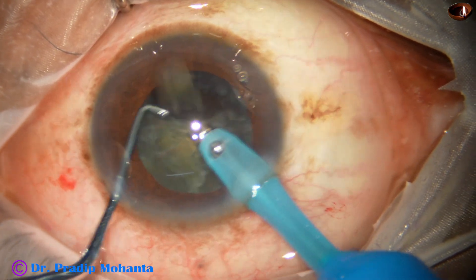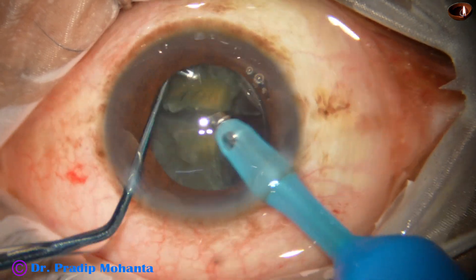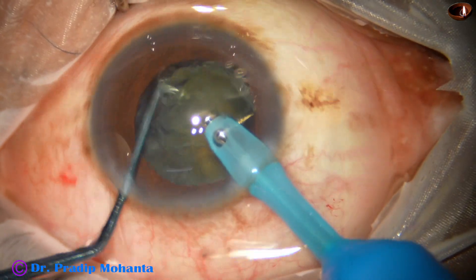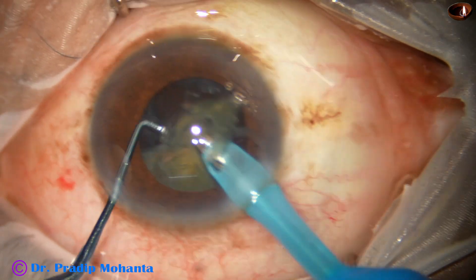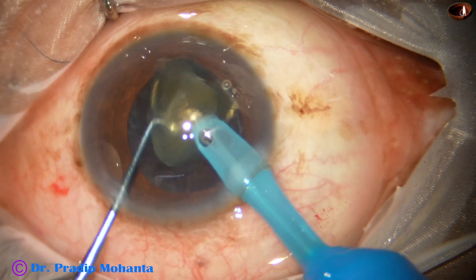In few seconds, one hemi nucleus is emulsified. Now we come to the other hemi nucleus — the first piece is emulsified and this is the last nuclear piece.